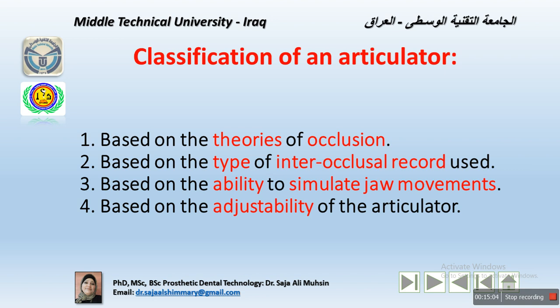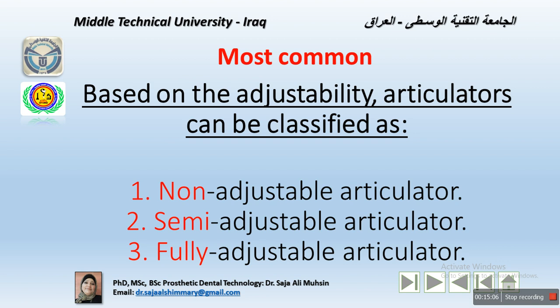The most commonly used, for every type of restoration, is based on adjustability, and this is classified into non-adjustable articulator, semi-adjustable articulator, and fully adjustable articulator.